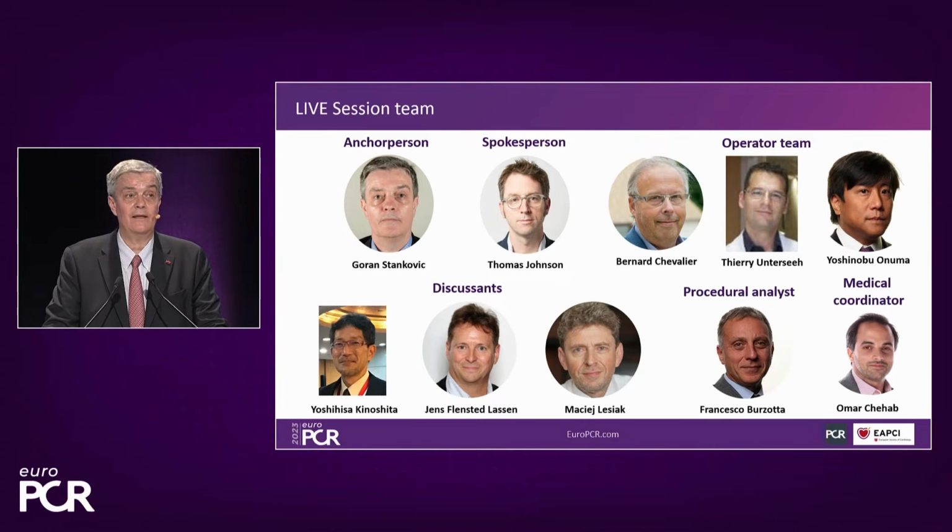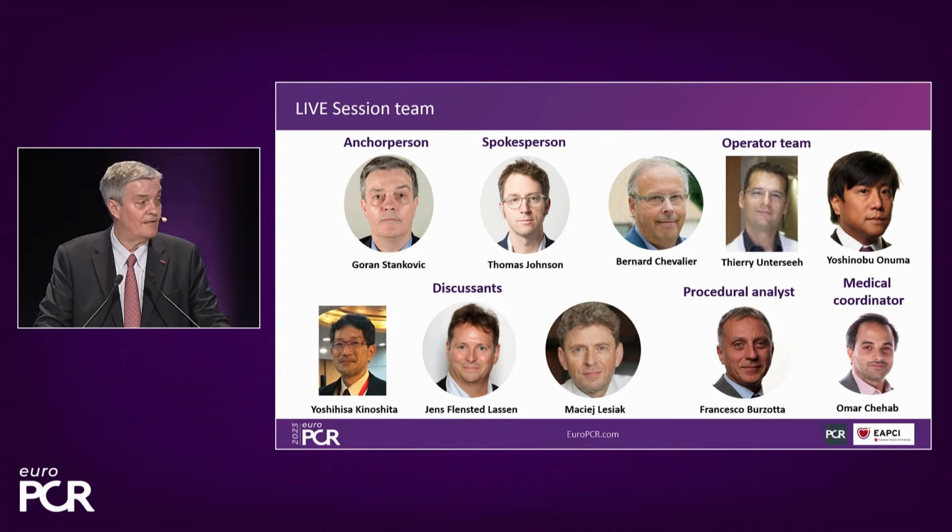And today we have a great team to discuss complex left main trifurcation LAD diagonal PCI. Together with me is Tom, and then we have fantastic discussants, Dr. Kinoshita, Jens Lassen, Maciej Lesiak, Francesco Burzotta. And we have a great team in Massy.